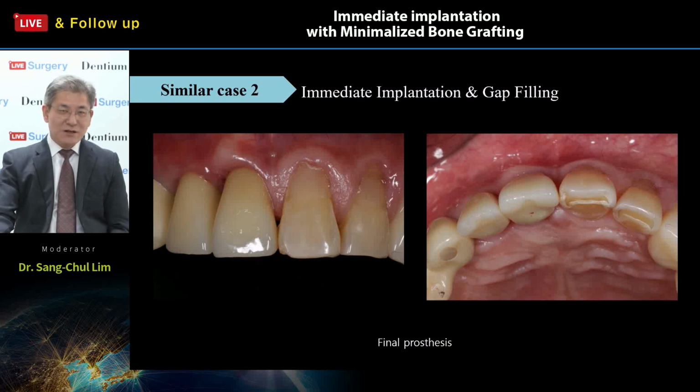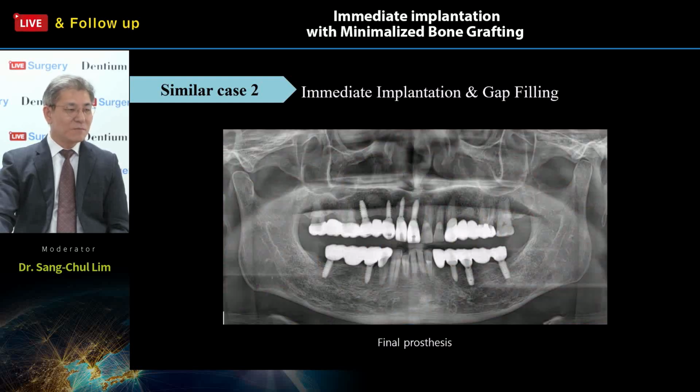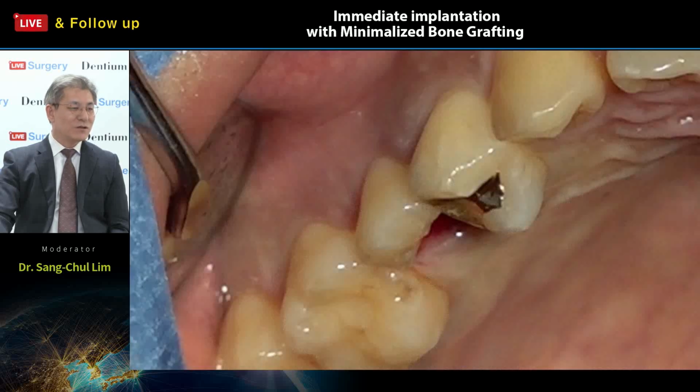The outcome is better, right? So I am satisfied and also the patient is satisfied. Okay, the final restorations delivered, and then taking this panoramic view, we're going to see clearly this number 11 and 12 area with a better emergence profile and a good marginal bone situation.